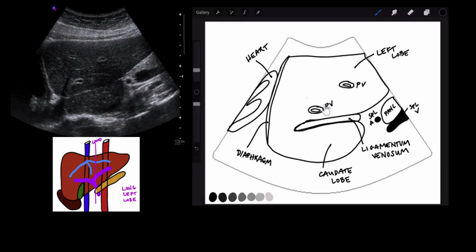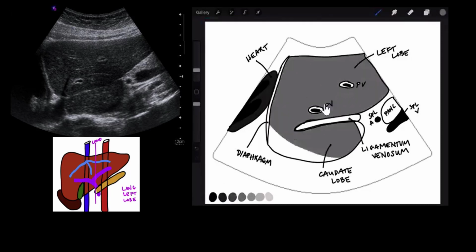Now what I like about this picture is that we really are showing that caudate lobe nicely. We're showing all the way to the posterior side of it. What I've seen in the past is that a lot of students tend to kind of clip the caudate lobe, not increasing their depth enough to see all of the caudate lobe. This caudate lobe image also shows us that the caudate lobe does sit more on that superior portion of the liver on the posterior side. This is also a good example showing the echogenicity comparison of the liver compared to the pancreas.